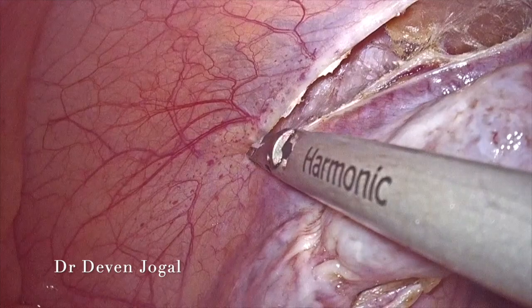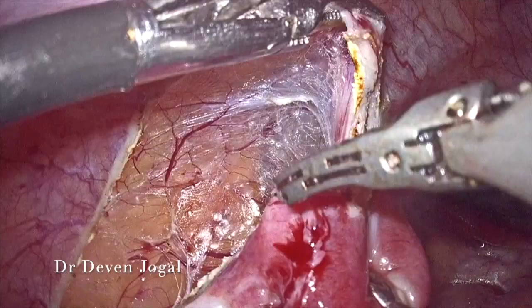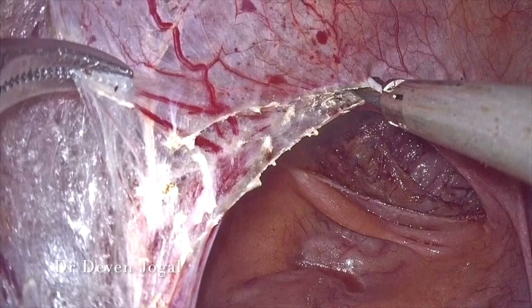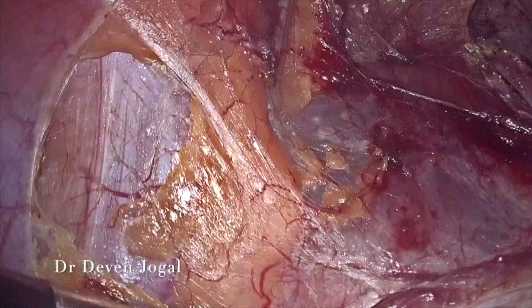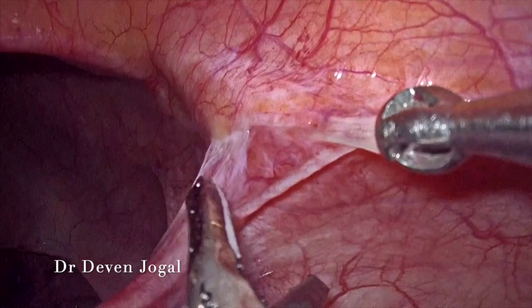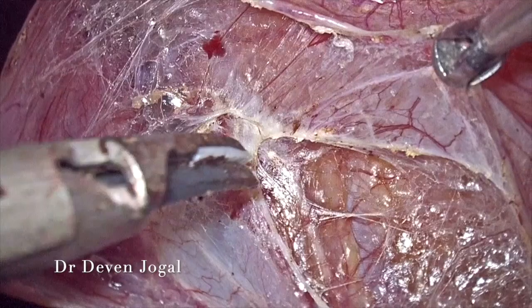The peritoneal fold was cut lateral to the IP ligament. The purpose of this lateral dissection is to mobilize the ovaries as medially as possible. This is the remnant of the round ligament we are cutting. The purpose is to ensure both ovaries are medialized so that whenever the patient is treated for infertility, ovum pick-up can be done easily through the vaginal route instead of transabdominal ovum pick-up, which is a difficult task.